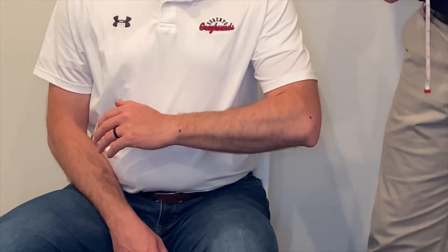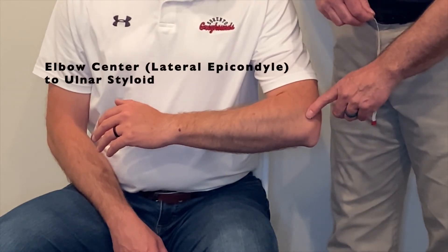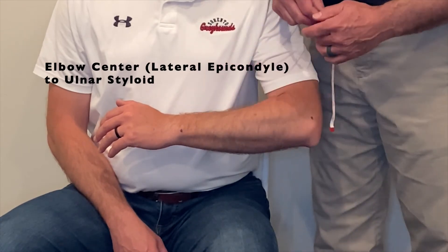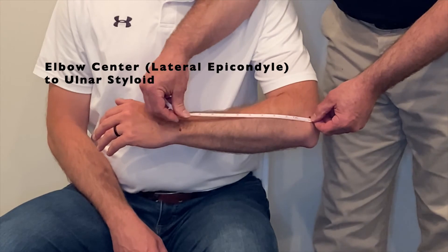Our second measurement of the forearm will be from the elbow center — in this case the lateral epicondyle — down to the apex of the ulnar styloid. In this case we get ten and a half inches.